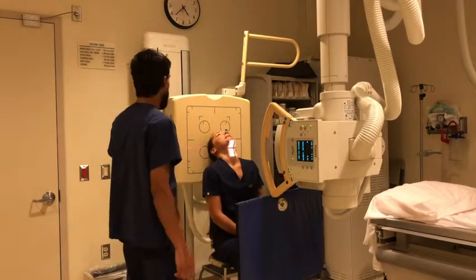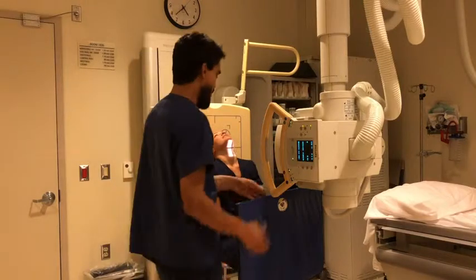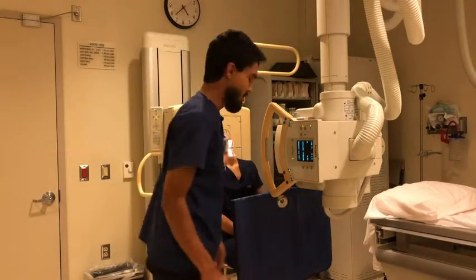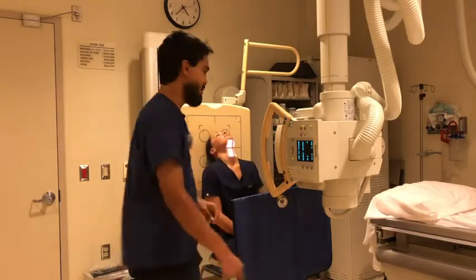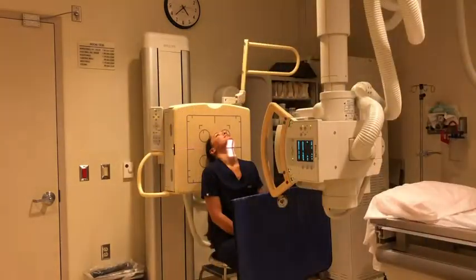Alright, the board's going to move a little bit. Alright. And we're going to shoot this X-ray at 85 kV and 14 mAs. Alright, X-ray.